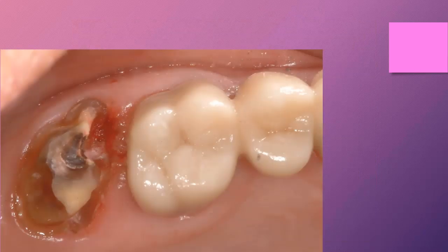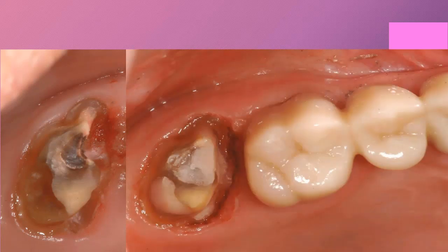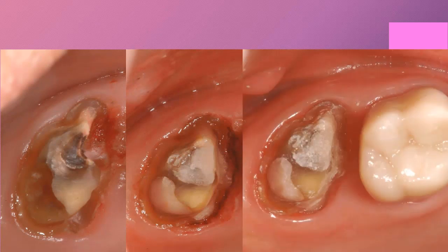Here's another example. Deep decay, sclerotic damaged dentin. We're under the gum line. We have bleeding present. So we take impressions. We utilize lasers to control bleeding. Patient comes back after a couple weeks of healing. You can see we used the laser here. When the patient comes back, you can see the tissue is healthy from having utilized a laser. We know bacteria cannot colonize on tissue for 4 weeks or more after using a laser, hence we have healthy, happy tissue. And so for this, again, resin-modified glass ionomers may give us a great advantage here because of working in a moist subgingival environment.